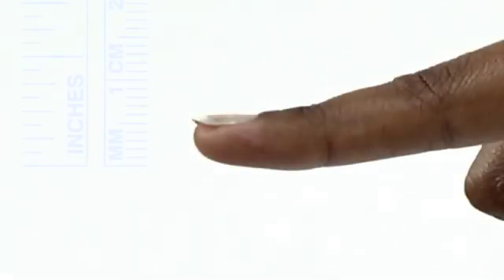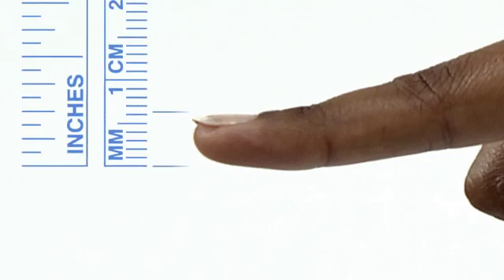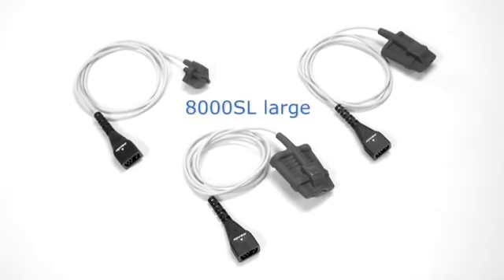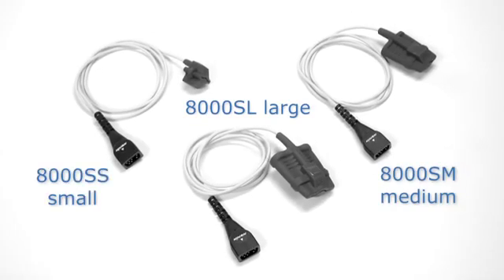Proper sizing is very important. Measure the thickness from fingernail to the finger pad at the center of the fingernail. Soft sensors are available in large, medium, and small sizes for different finger or toe thicknesses.